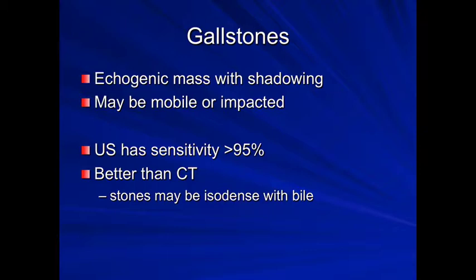Ultrasound is very sensitive for gallstones and has a reported sensitivity of greater than 95%, and in fact this is better than CT, because stones may be isodense with bile and so may not be apparent at all on CT.